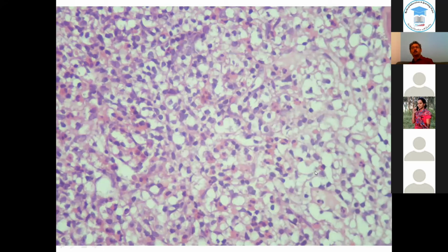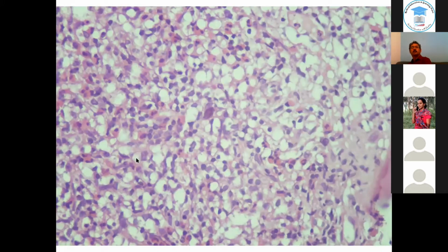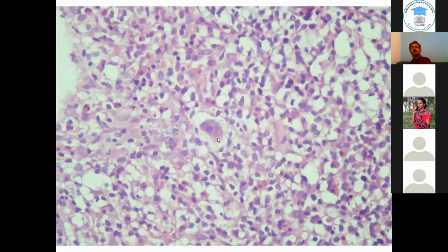And now I'll tell you the story. This patient was diagnosed as having a Hodgkin lymphoma, and a bone marrow was done to see whether he had bone marrow involvement or not. And there are many eosinophils out here. Maybe something out here. And yes, certainly when you look at serial sections, when you look at other sections, you can see in fact this is a binucleate cell. And this is clearly a Hodgkin involving the bone marrow.